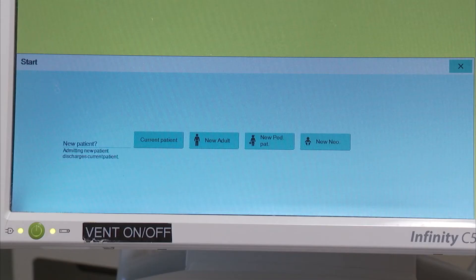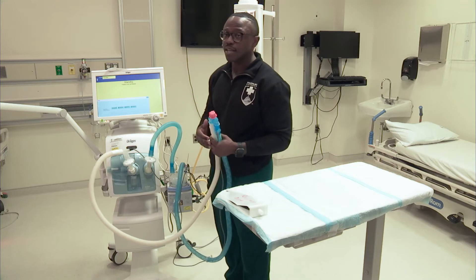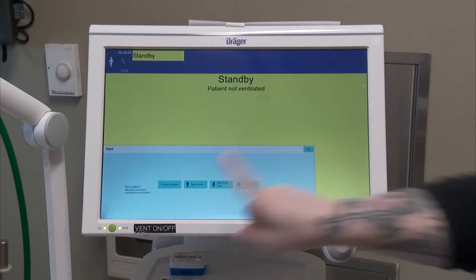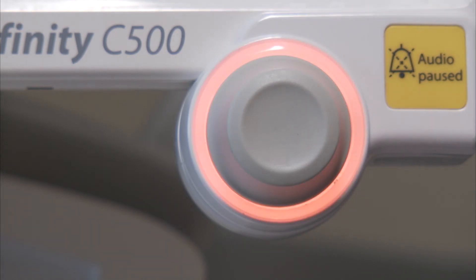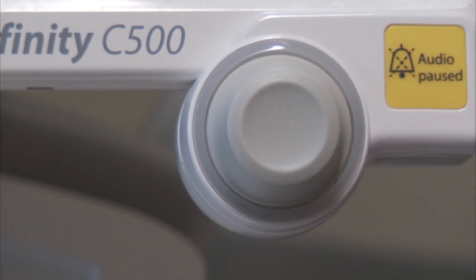You also have new adult, pediatric, and neonate. When you press one of those, it'll preset some of the parameters to match with that patient population. For today's lab, I'm going to select new adult. When I select it, this rotary knob lights up yellow — you want to confirm what you're doing with the knob.